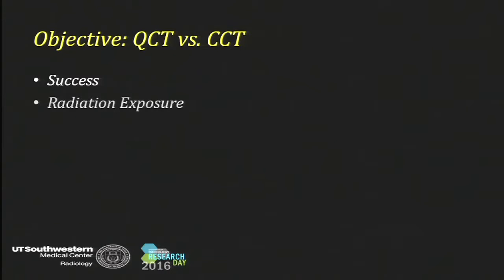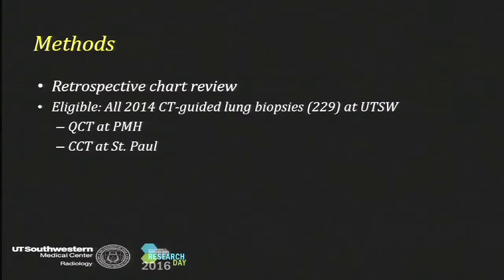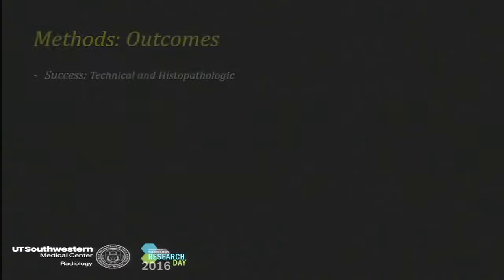Now, we designed a study with the goals of comparing QCT and CCT, the conventional technique for lung biopsies, and evaluating the difference between success, radiation exposure, efficiency, and complications. Now, we did a retrospective chart review, all 2014 CT-guided lung biopsies at UT Southwestern performed by the same team of interventionalists was included. QCT was used at Parkland Hospital, CCT at the old St. Paul Hospital. We excluded 64 cases due to missing images in PACS. We didn't have the information for those, as well as non-standard CT protocols were also excluded.